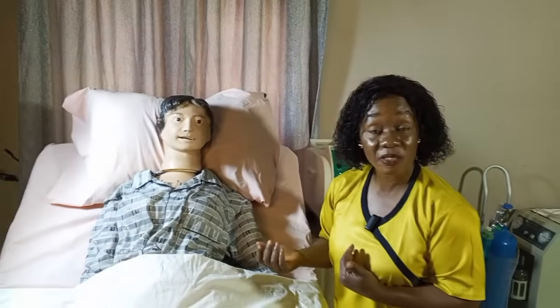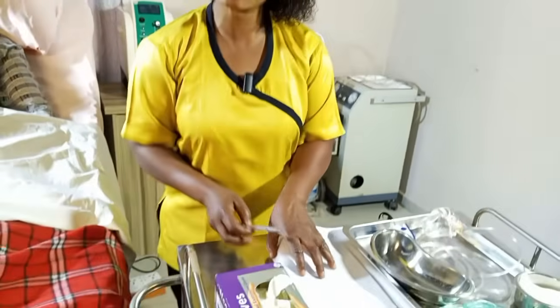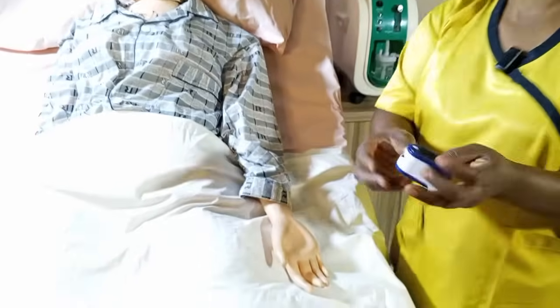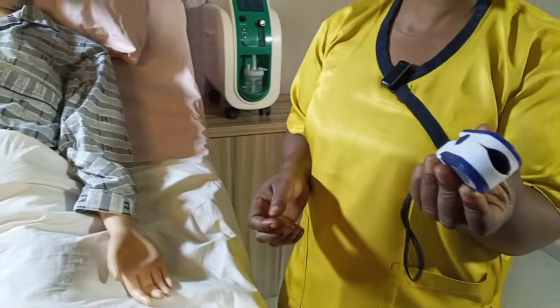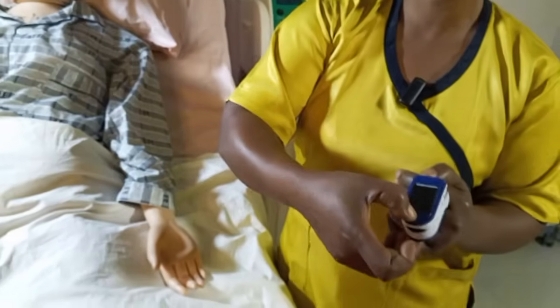Now that I've placed this patient in a 60-degree Fowler's position — that is, cardiac position — the next thing is for me to check the prescribed liters of oxygen. I take my patient's prescription sheet and check: the patient has been placed on 3 liters per minute. Also, before you administer, do not forget to check your patient's oxygen saturation first — either using a monitor or a pulse oximeter.